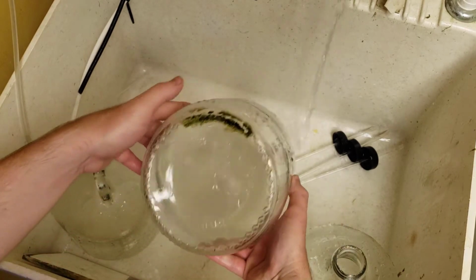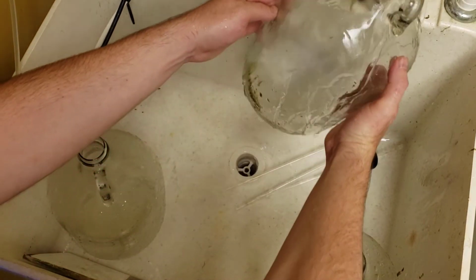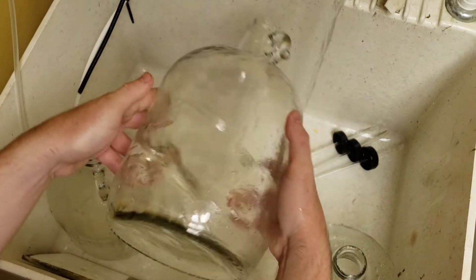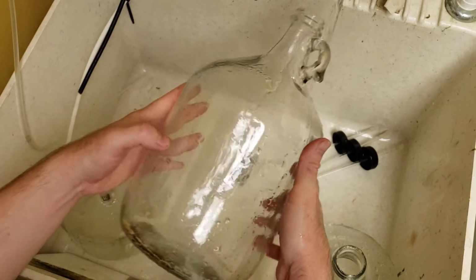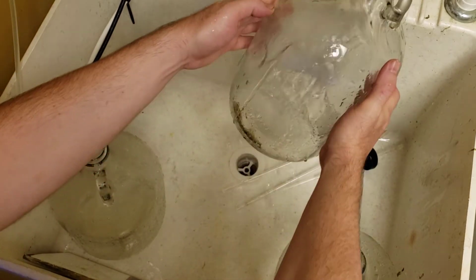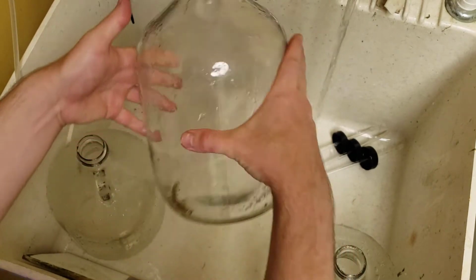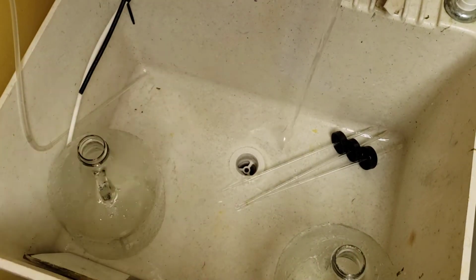Okay, this isn't washing off. So this will have to soak again, but at least now there's less calcium to deal with. You can already see this is cleaning up nicely, except for that bottom part. So I'll do that one again. Just put it aside.